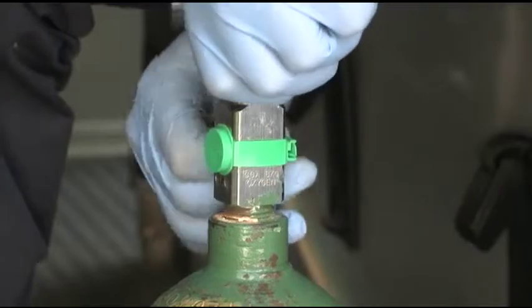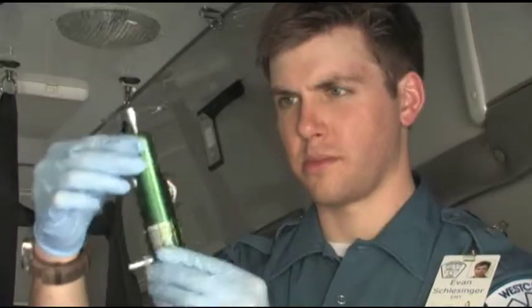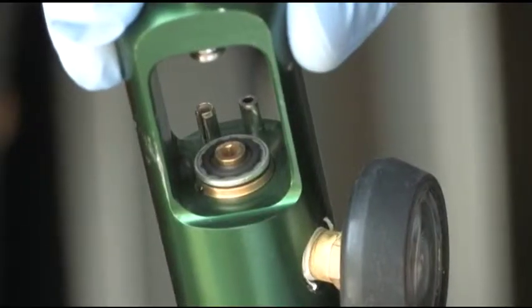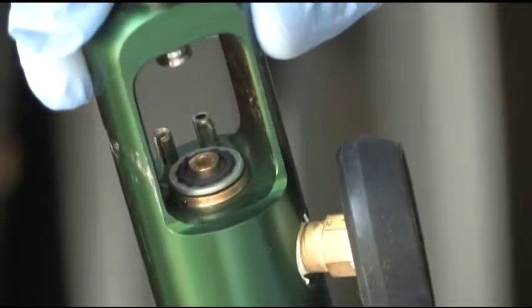Remove this protective seal from the tank valve. Make sure the oxygen regulator has an O-ring or washer in the area where the oxygen regulator fits with the oxygen tank.